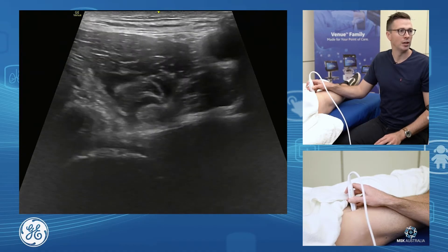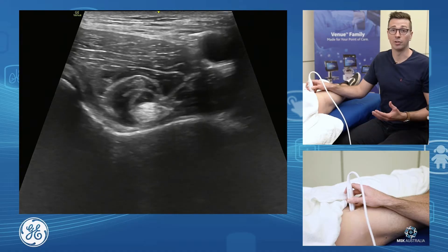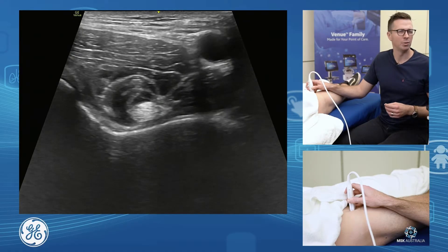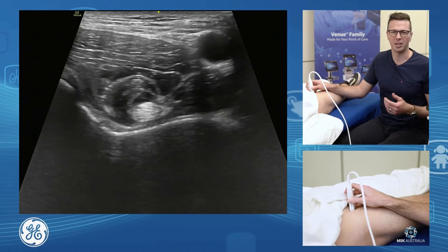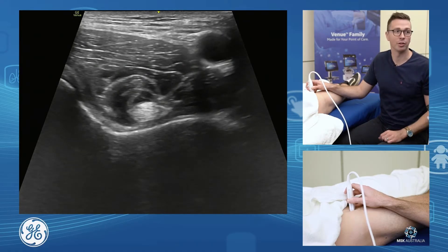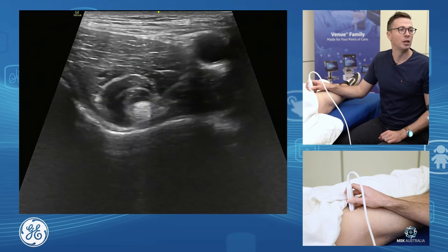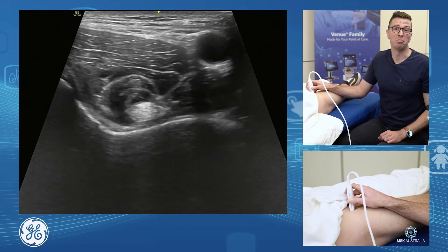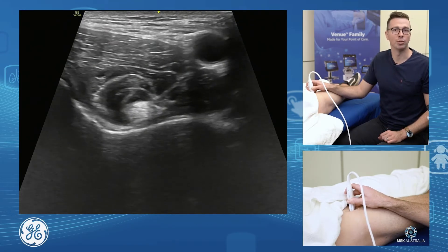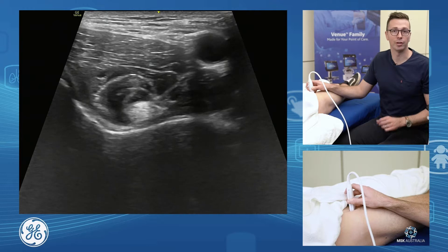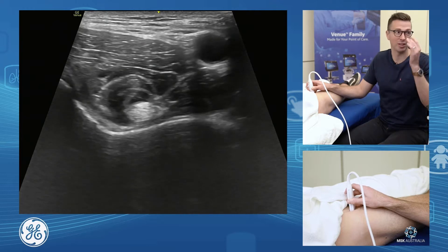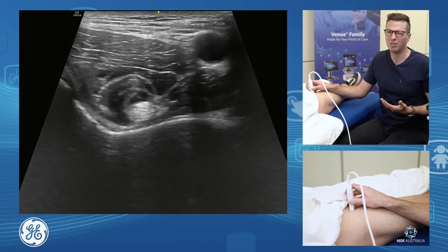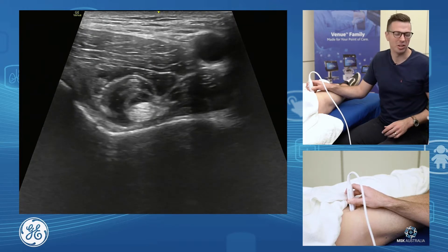This is where we look for iliopsoas bursitis, which is often secondary to hip joint pathology itself. Remember that the iliopsoas bursa, in most cases, is contiguous with the hip joint itself. So if you're doing an iliopsoas bursal injection, you're really doing a hip joint injection.